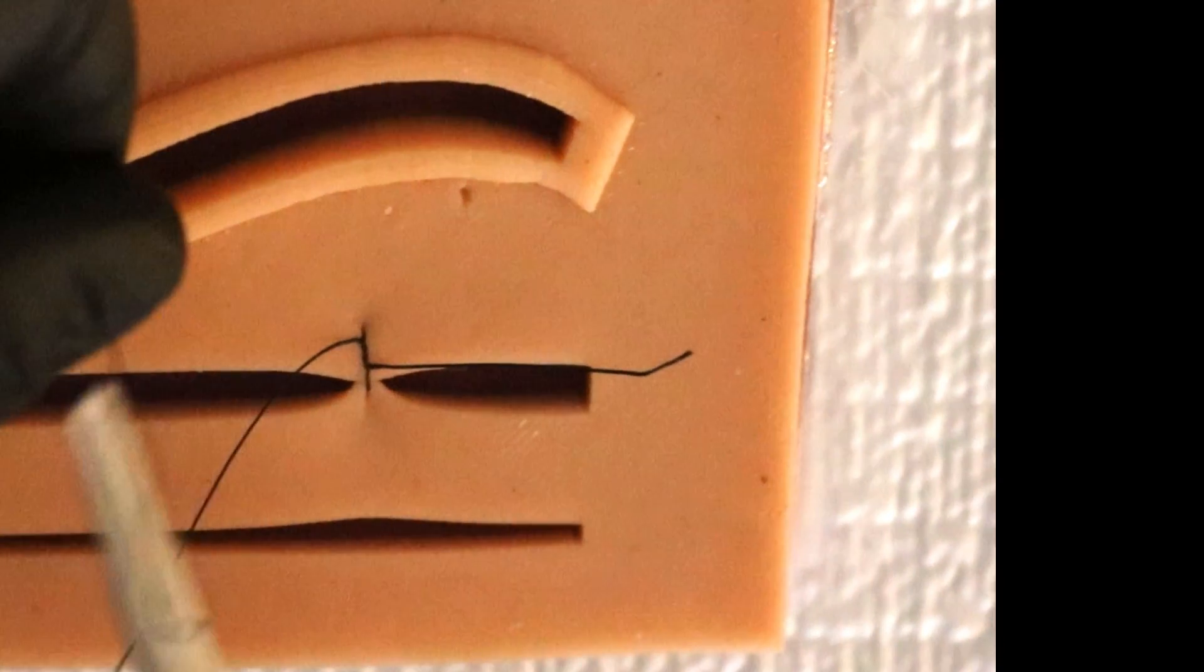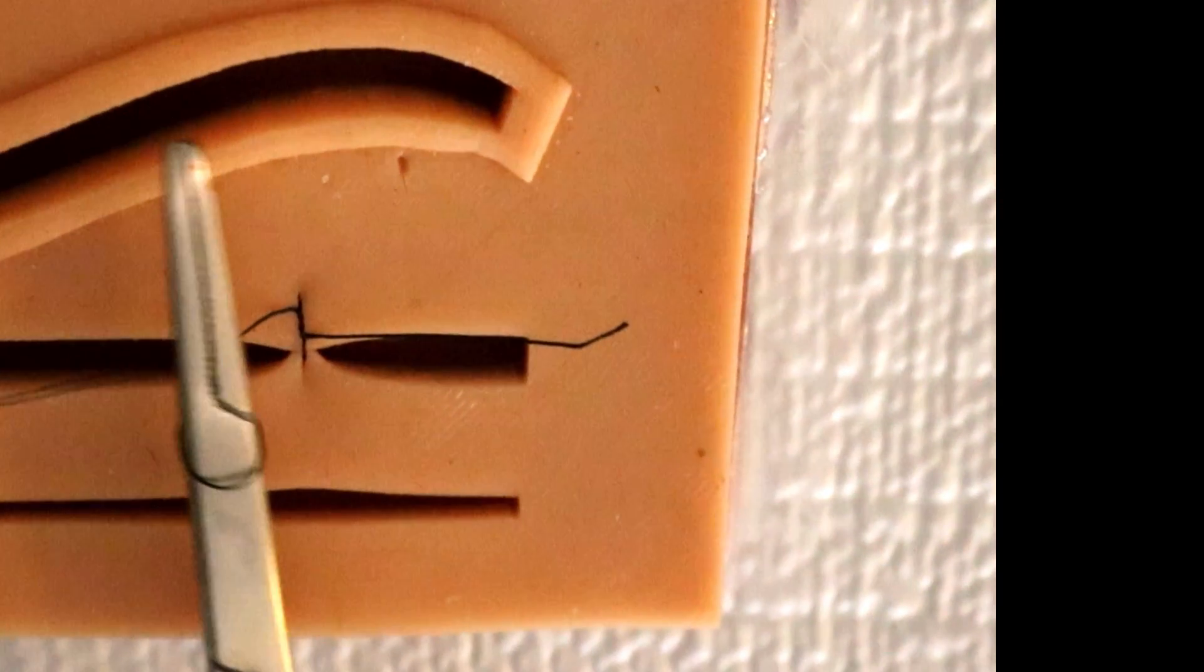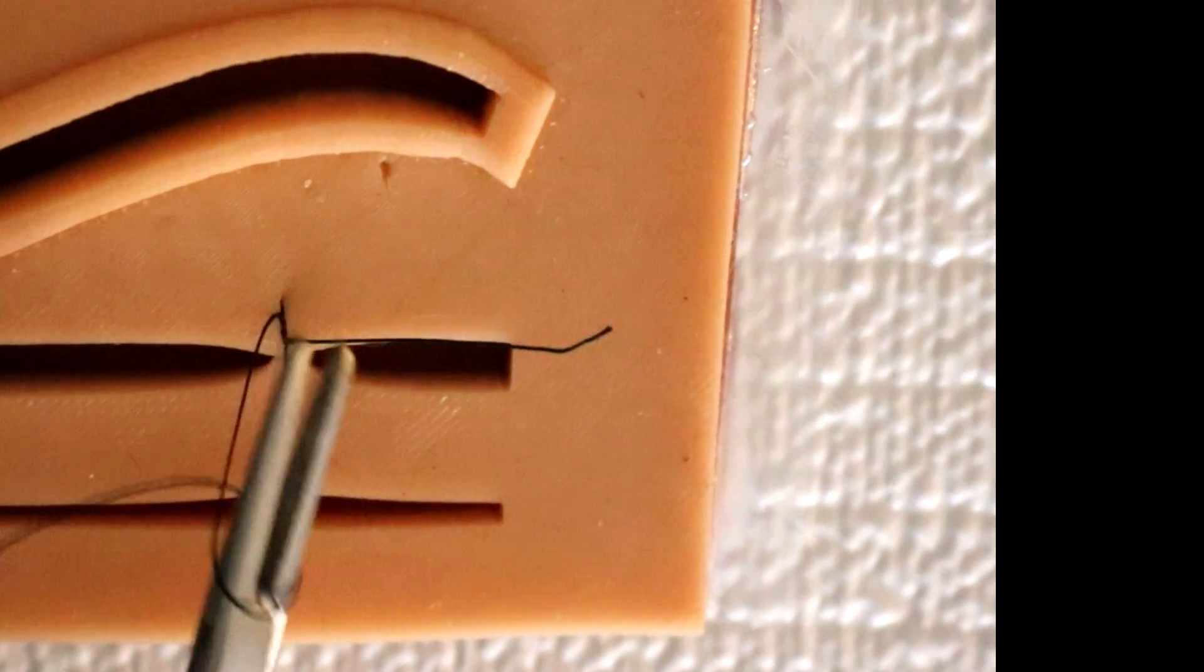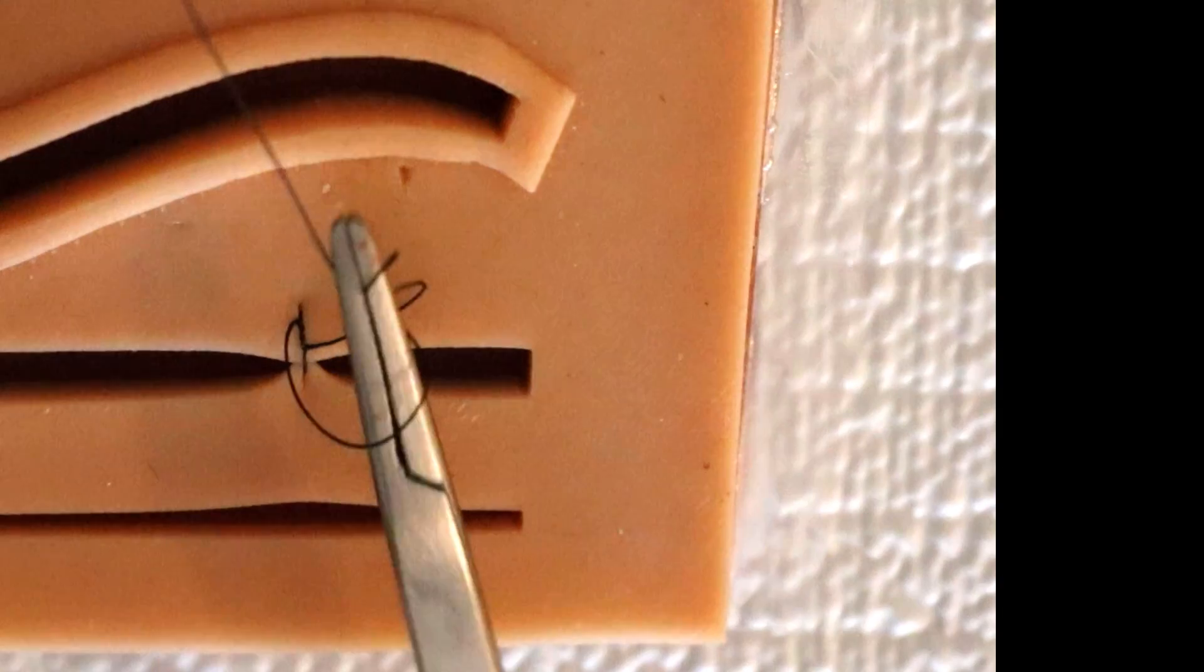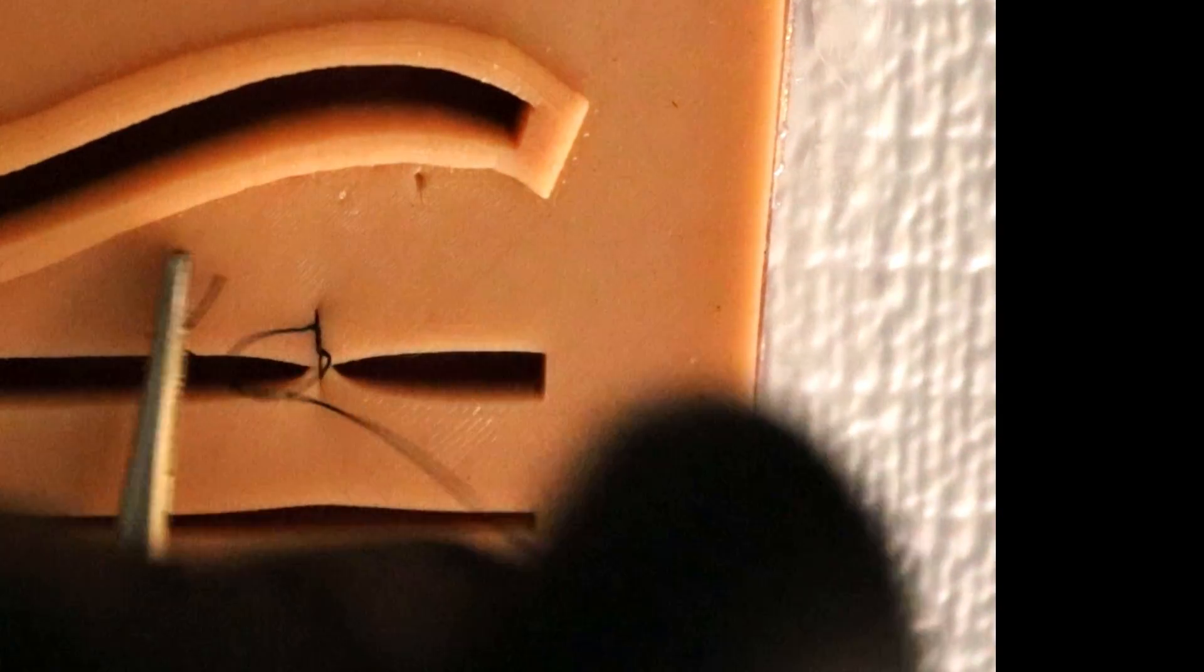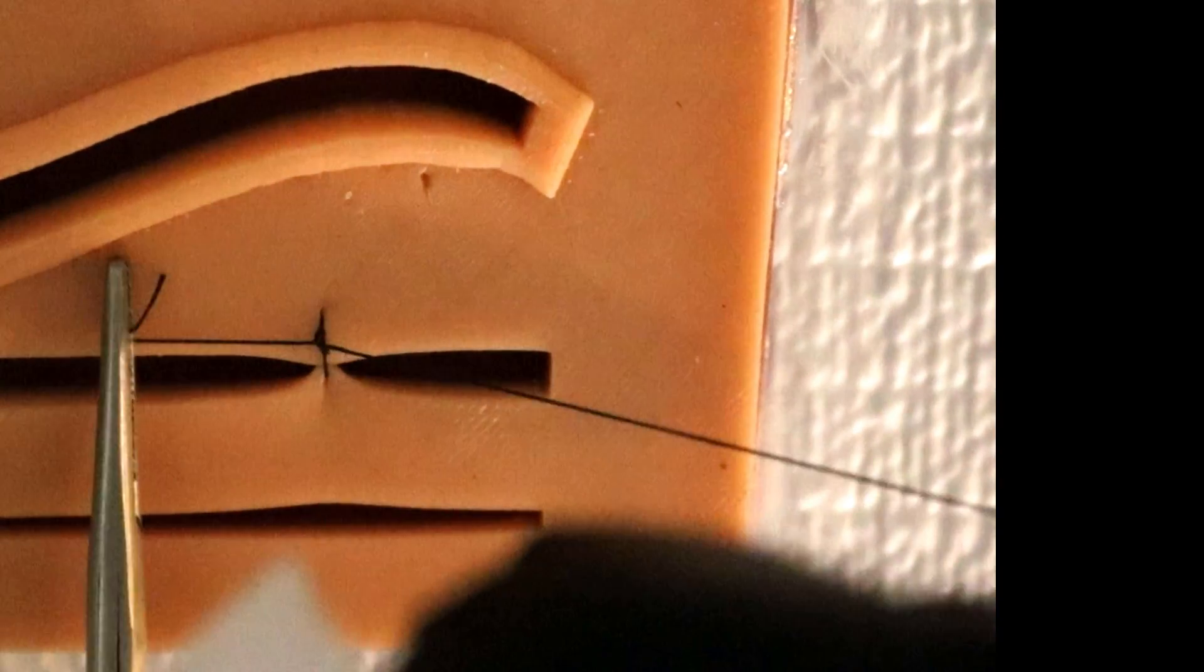Second throw. One loop. And you grab the tail and you're gonna pull through. Again, hands crisscrossing. How much of a tail you should leave? Well that's a great question.